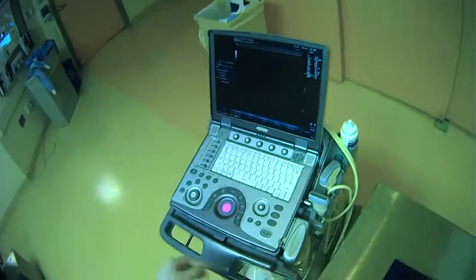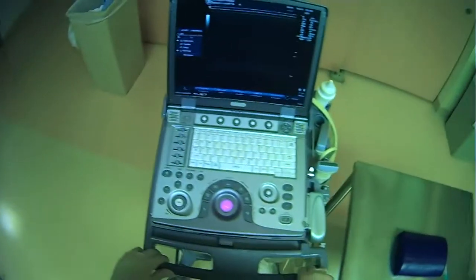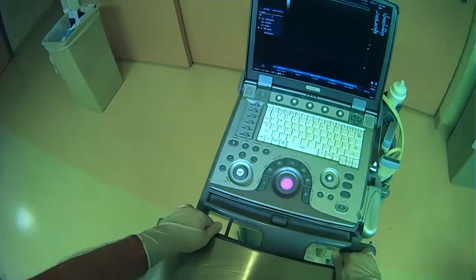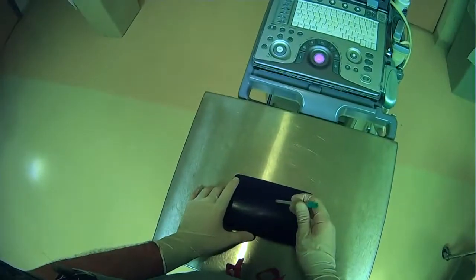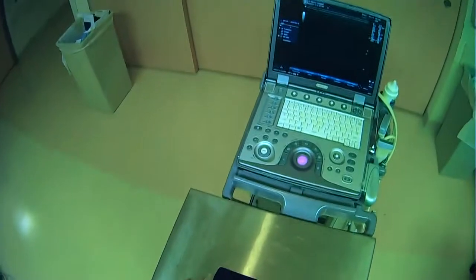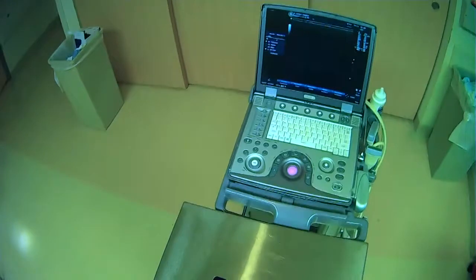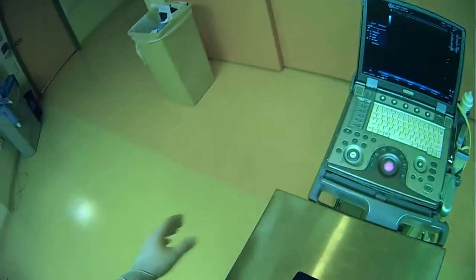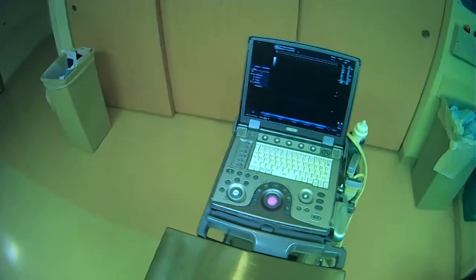So you may want to consider moving the machine over to the front of your work surface. The advantage with this is that as you're working, you can just glance up and look at the screen in front of you. All the orientation remains the same, you don't have to crank your head to either side, and the machine is not in your workspace — it's across from you and not going to be getting in the way.